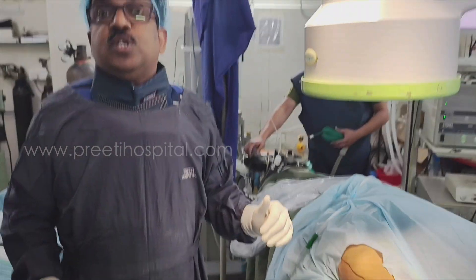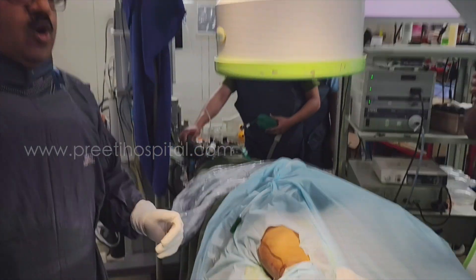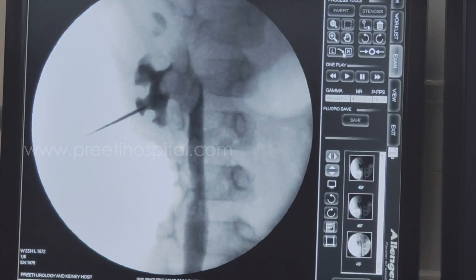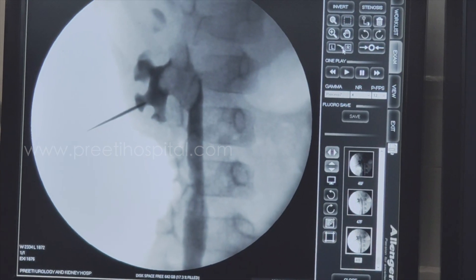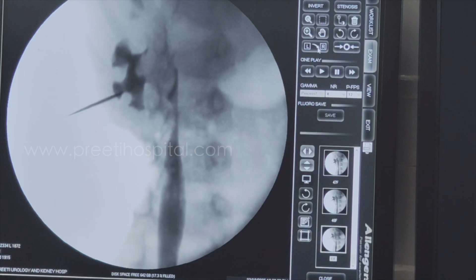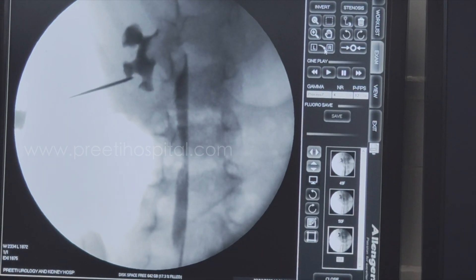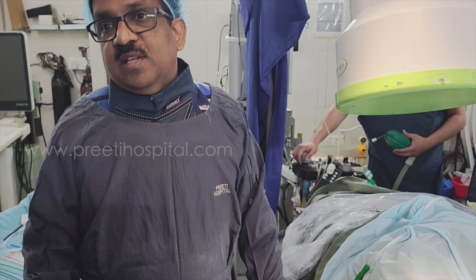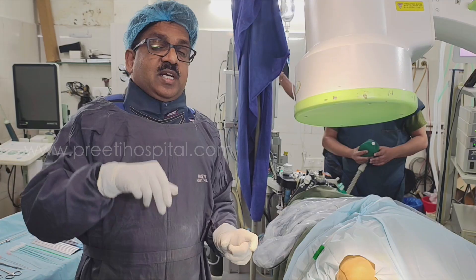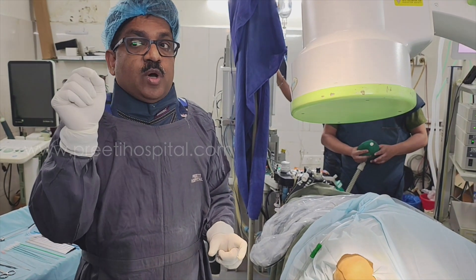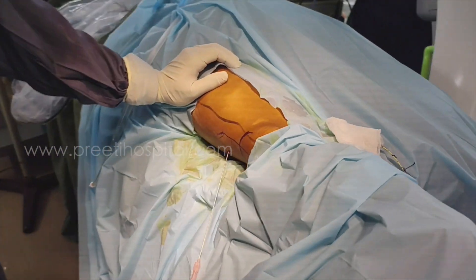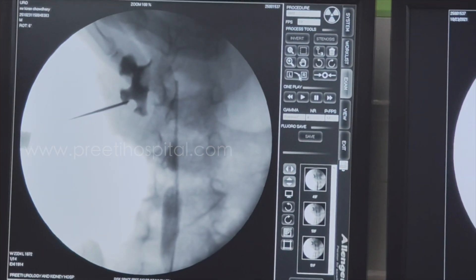All degrees: if it is in the correct position, it should stay in the same place. It has gone down — first 5 degrees looking same, after 30 degrees looking a little down — that means you are missing the bite by a narrow margin. No need to remove. Coming down means you are anterior. What should I do? Come back a little. At 30 degrees only you keep — just withdraw and go more posterior. See how much it is dipping.